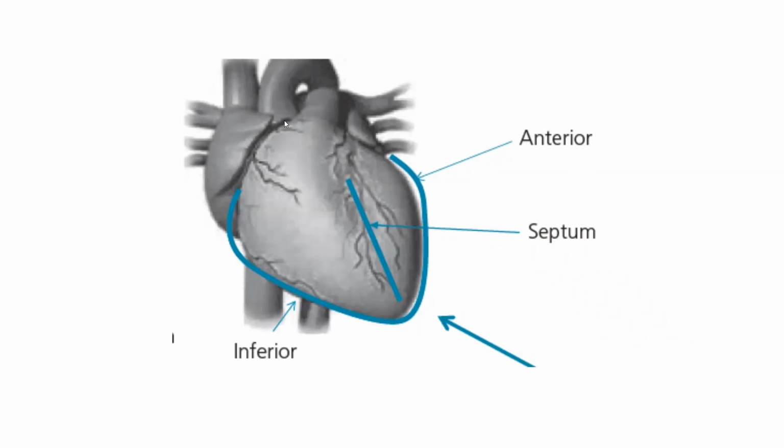So the PA base is higher than the aortic base, which can explain to you how an anomalous coronary can course beneath the PA. It arises from the aorta and can course beneath that PA base into the septum, then emerge epicardially, the so-called subpulmonic or septal course.